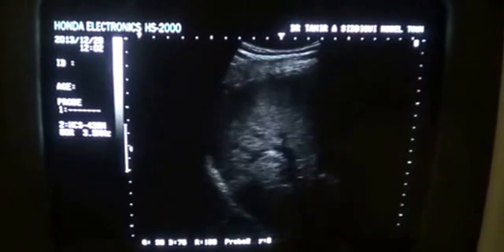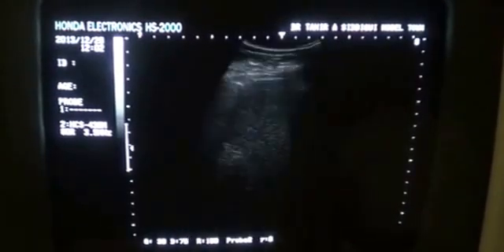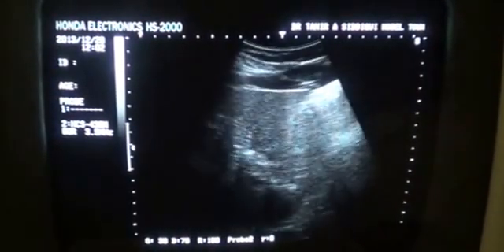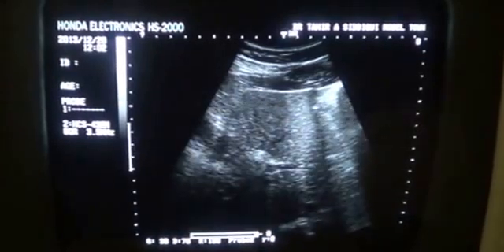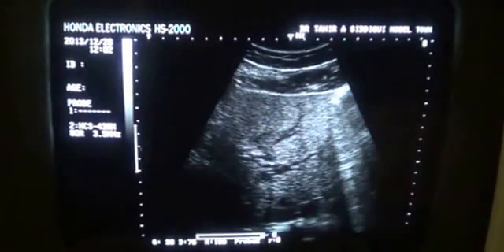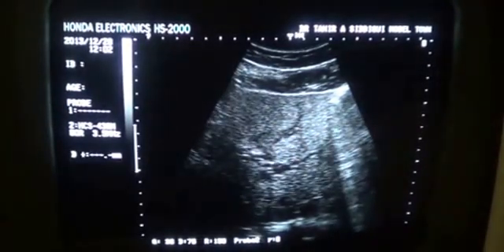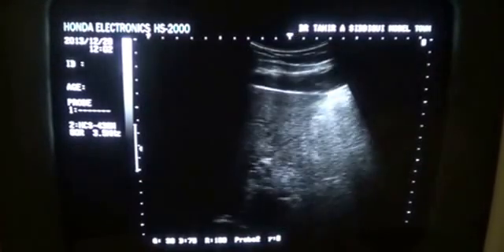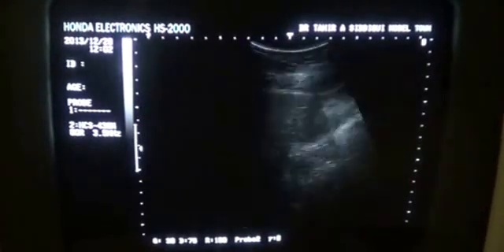And here we see dilated intrahepatic bile ducts. All these ducts are dilated. Once the ducts are dilated, the intrahepatic ducts are dilated.